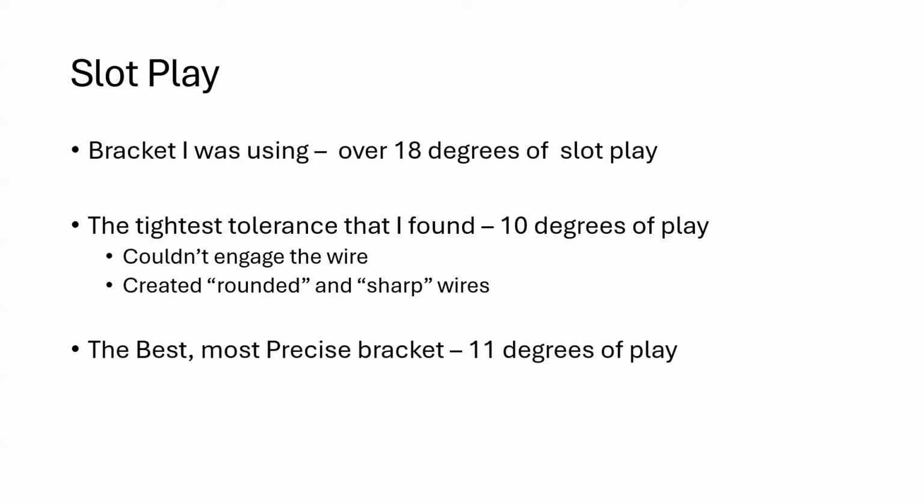And we landed on the Pitts21 Pro. And man, what a game changer that bracket has been. And we adopted that November of last year. So we're about 15 months into the journey, and it has just been phenomenal.